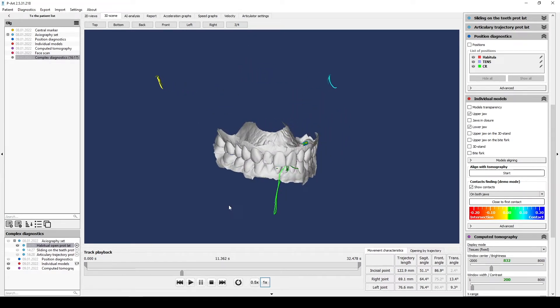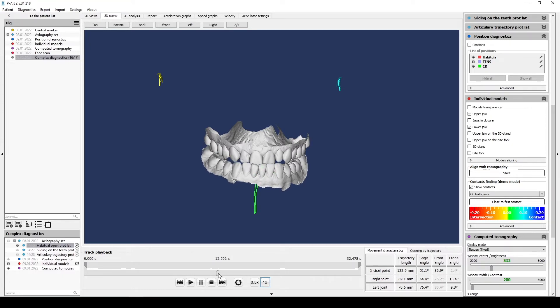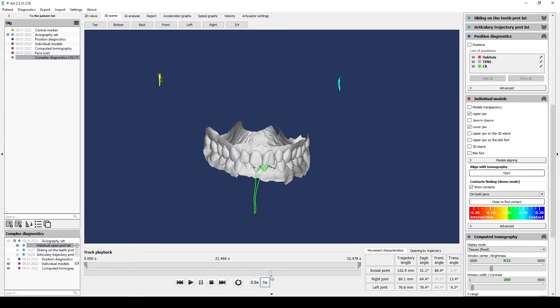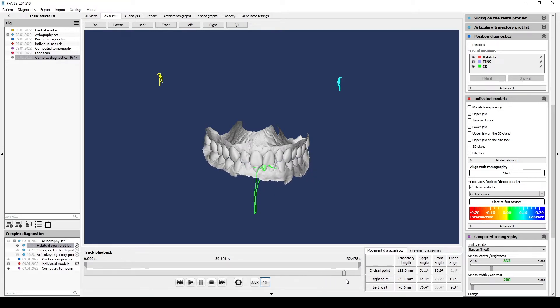And also analyze forward movement, protrusion, left and right movements. You don't give any advice to patient because you need to understand comfortable way to move the jaw, how stereotypically movement formed.